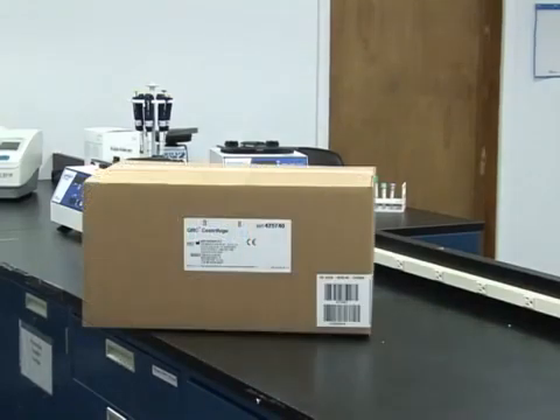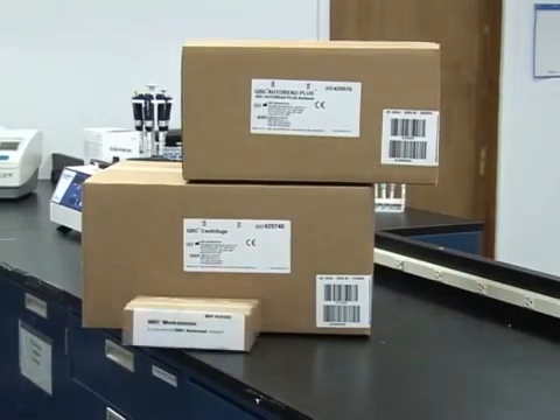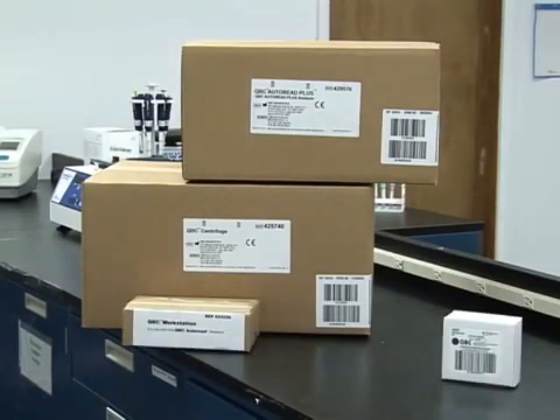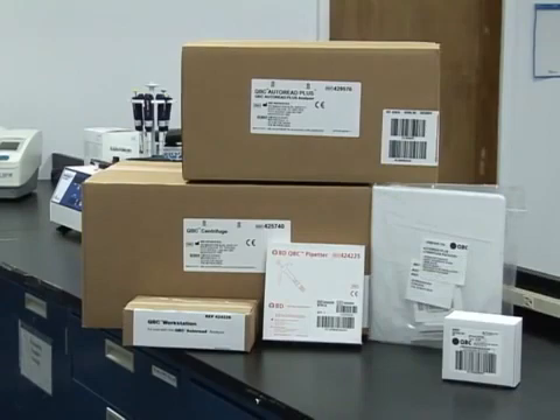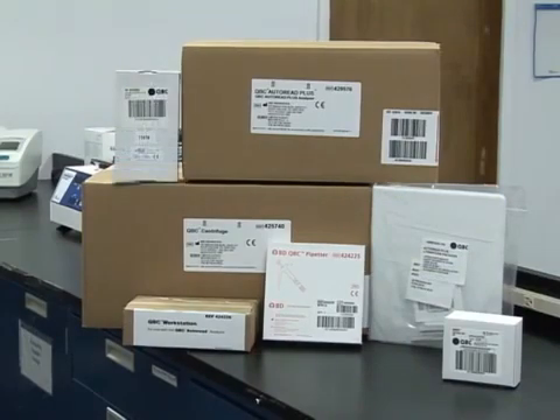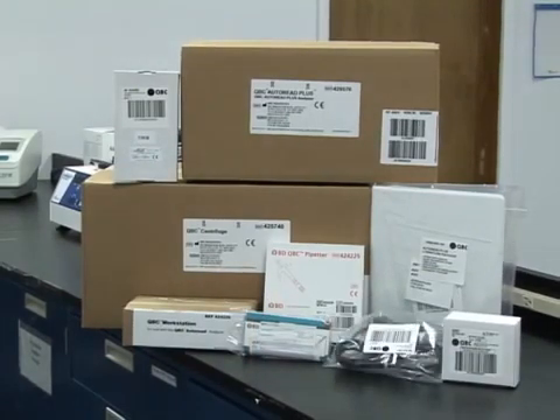A centrifuge, the Autoread Plus instrument, QBC workstation, software cartridge, pipe header with AccuTube spacer, paperwork, power pack, AccuTubes, and power cords.